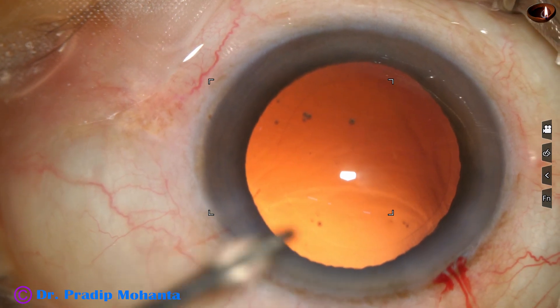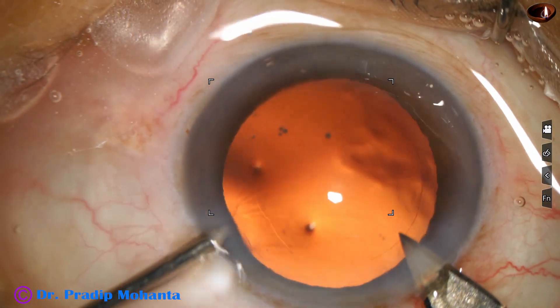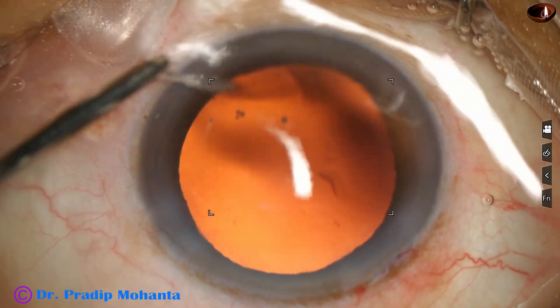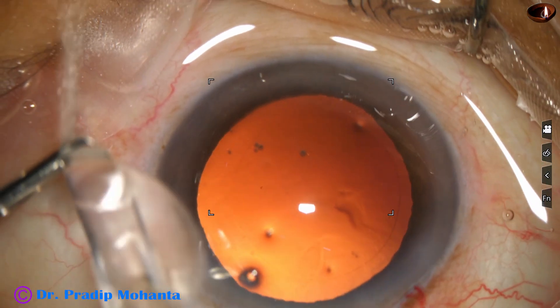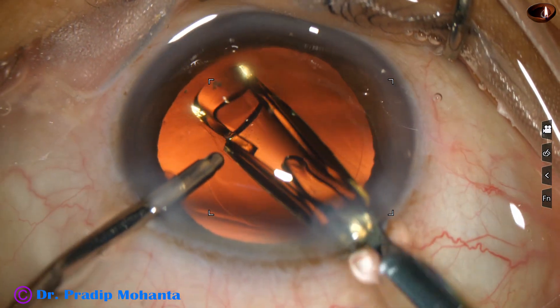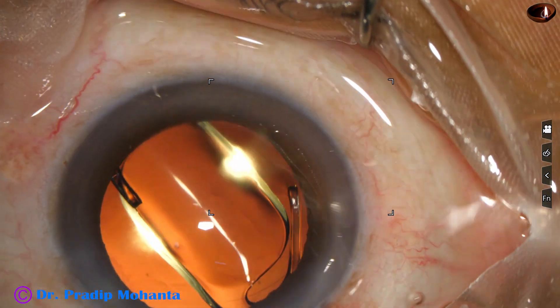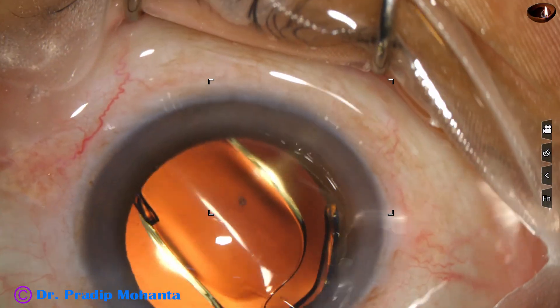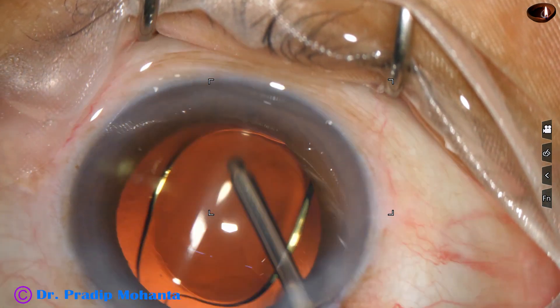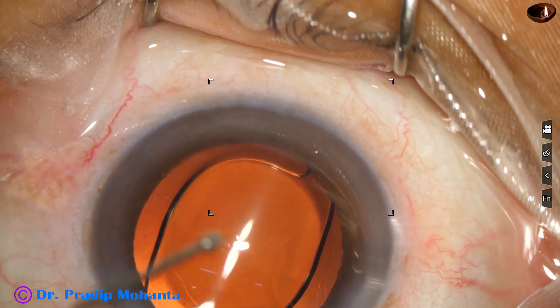And now, hydro-implantation of a single-piece monofocal intraocular lens will be done. Before that, this is enlargement of the main wound to about 3 millimeters — it was 2.8. I am using a B cartridge. If I do not enlarge the main wound, the lens may get stuck at the wound. And now the lens easily goes in; it is placed in the bag. The lens slowly unfolds, and the haptics are placed 90 degrees away from the main wound. This is a monofocal intraocular lens.